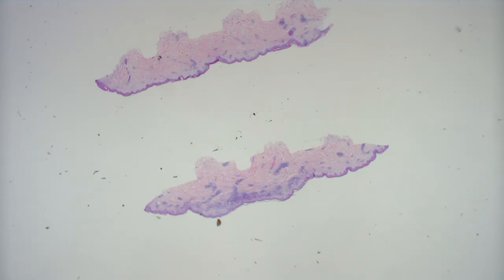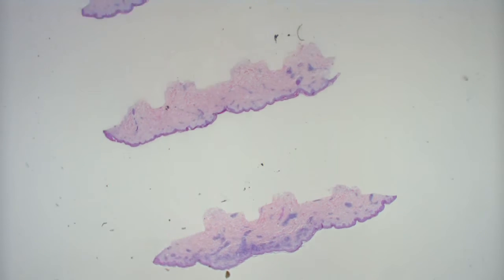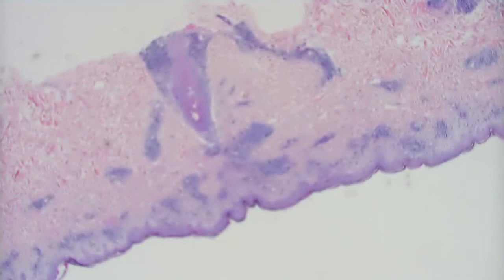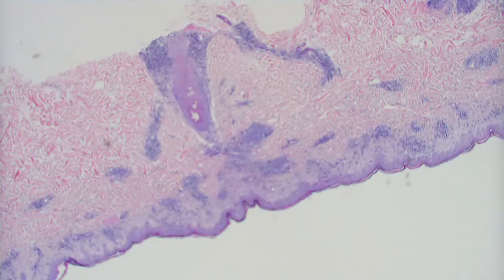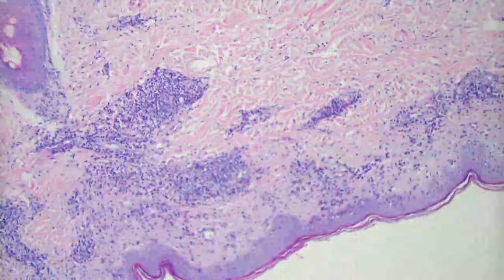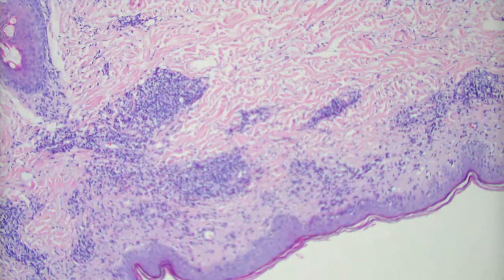Okay. Now we're back to 140. All right, so it looks like we have some superficial perivascular infiltrate. When I looked at it, there were a lot of plasma cells and lymphocytes. There were also some vacuolar changes. The architecture wasn't one that I classically think of for syphilis, but given all the plasma cells that I saw, that was definitely on the differential. Given the vacuolar changes, I thought I may have seen a little bit of mucin, so I put connective tissue disease also on the differential here.